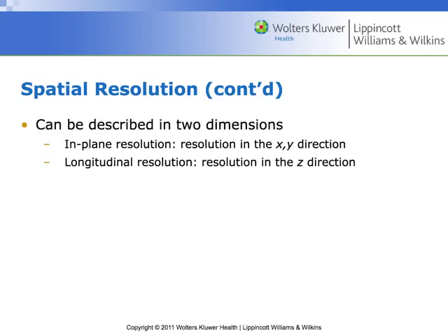There's two different ways, or two different dimensions, in which we might talk about spatial resolution. There's in-plane resolution, so that means within the scanner plane, the X and Y direction, right? Then there's longitudinal spatial resolution. That's along the Z-axis, and so it does have relationships to pitch.